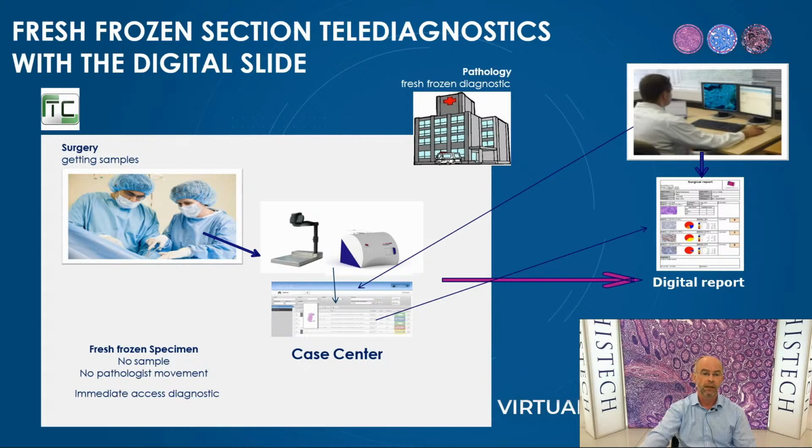appeared and was used, as well as surely approved, in a special field of fresh frozen section telediagnostics, where digital slide scanners, digital slide servers, and digital microscopes allowed us to perform a fast and rapid telediagnostics from the operation room into the operation room from our working room.